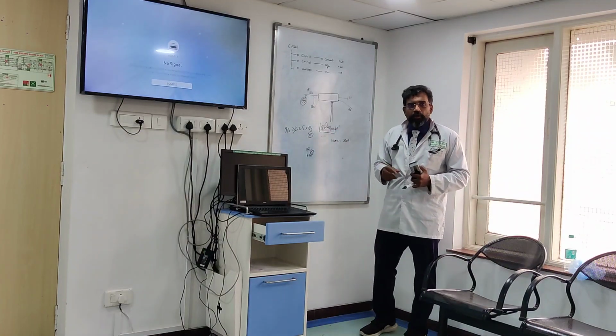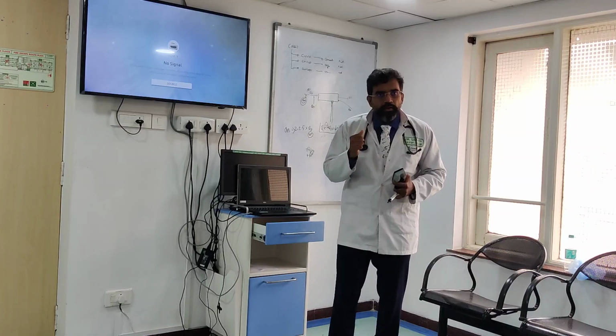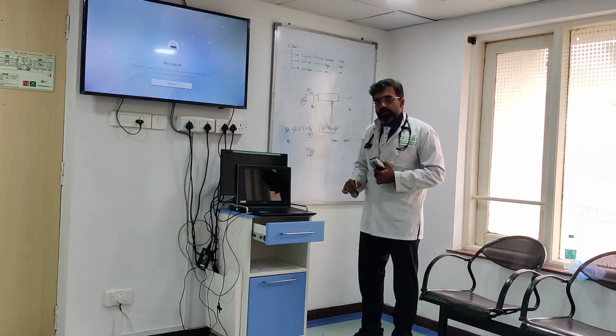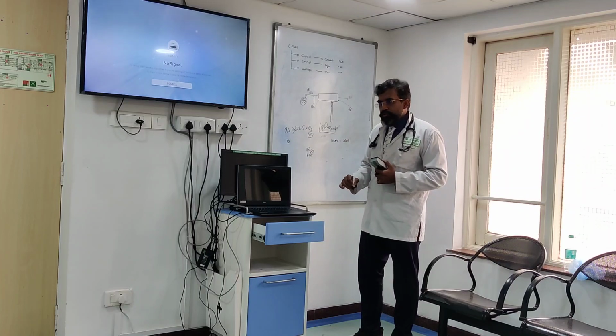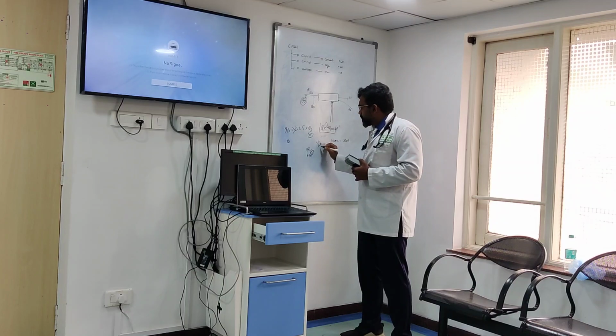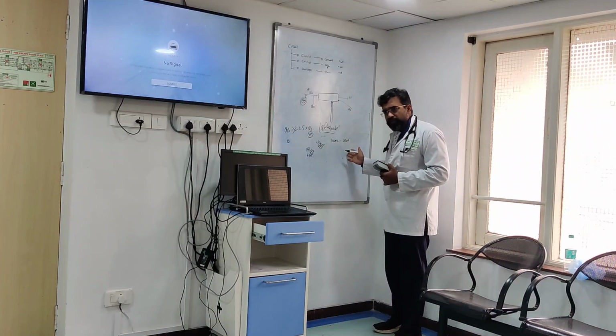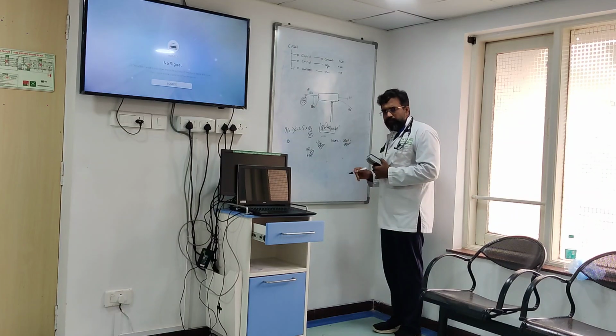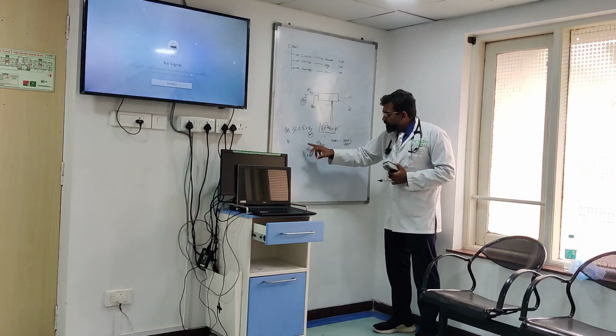Why am I telling you this? Because समझ लो कल तुम्हारा बीपी गिर गया और तुमने इसको 20-30 ml कर दिया, 30 ml कर दिया. Now let us multiply this 30 into 60. कितना हो गया? 1800. It is less than 2.5 times because I need to have at least 2000 to 2500 here. I make this 30.